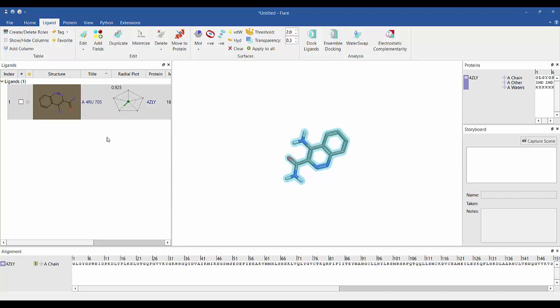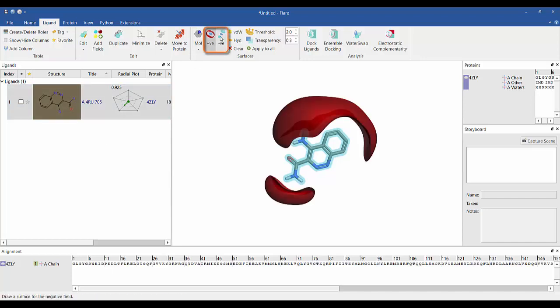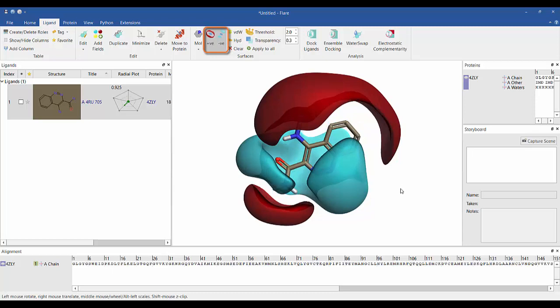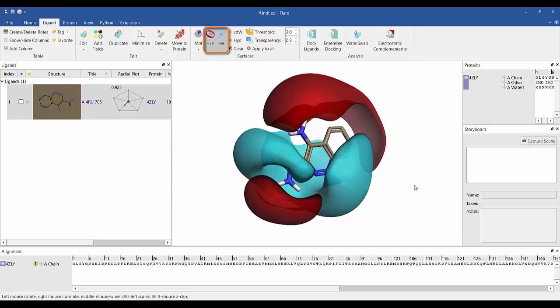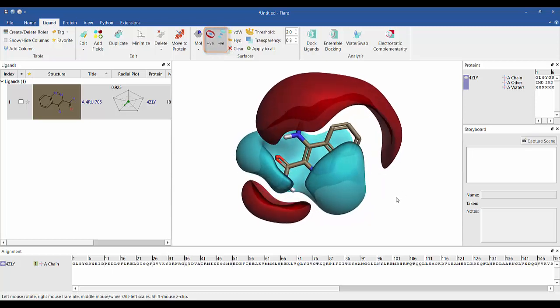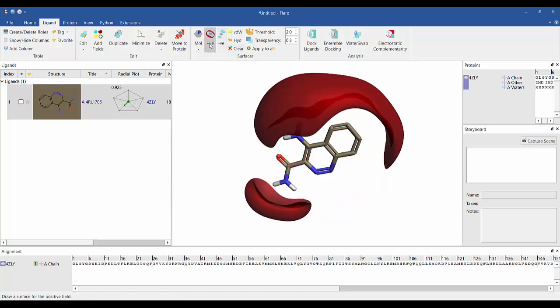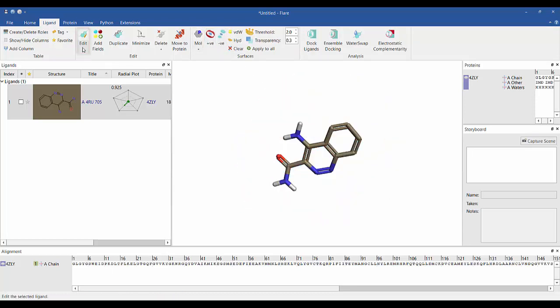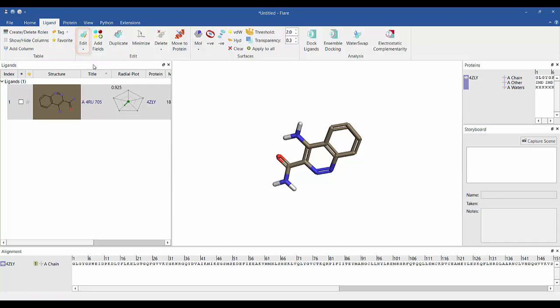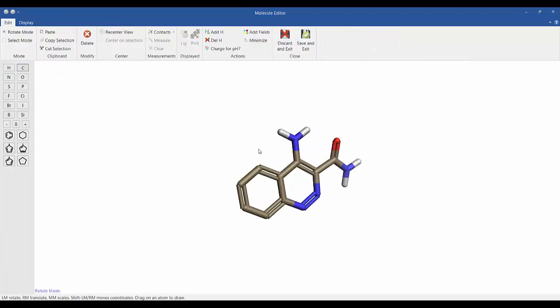Here we can generate field surfaces for the co-crystallized ligand to understand its electrostatics. We can edit the ligand using the molecular editor and see how the field surfaces update as we make changes.